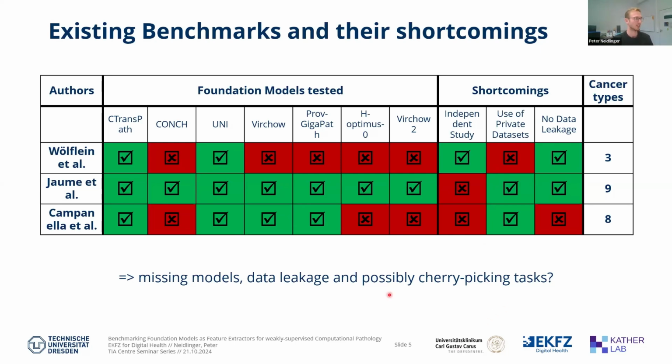And in the Virchow case, they even say in the paper that they cannot exclude data leakage, so that the pre-training of the Virchow model was also partly on the same data that was used for testing.